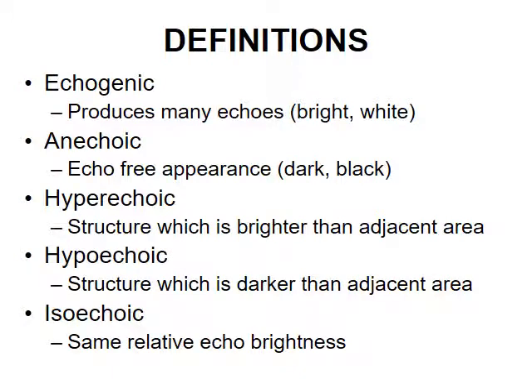Now, just to finish off our introduction, we're going to cover, I suppose it's the lingo, the ultrasound lingo or the terminology that we use in sonography. We'll use it when we're describing things. The radiologists use it too, so you'll find it in reports. So there's funny sort of special little words that are specific to ultrasound. So you do need to know what they are and what they mean.